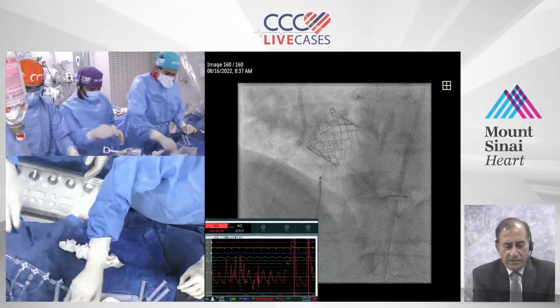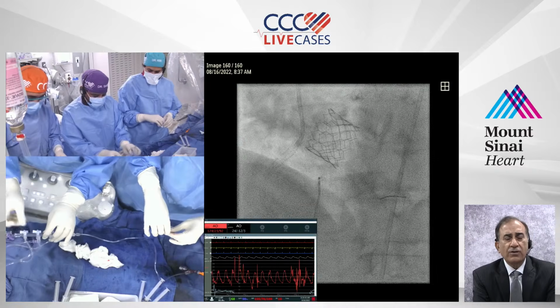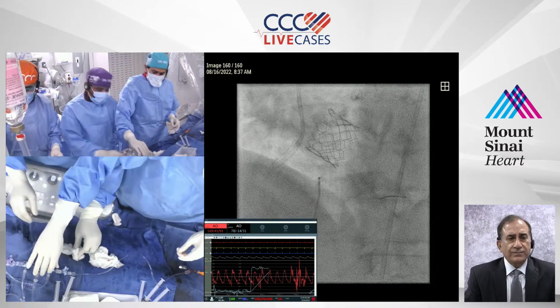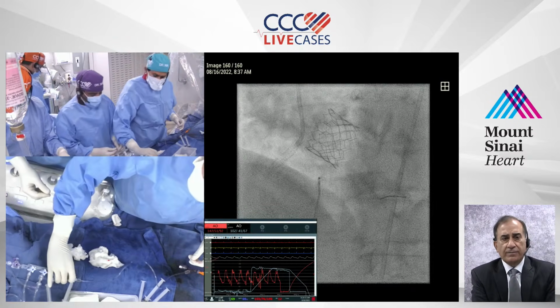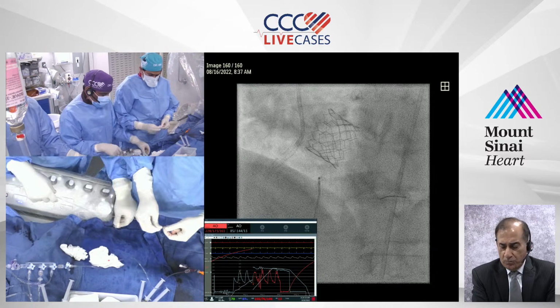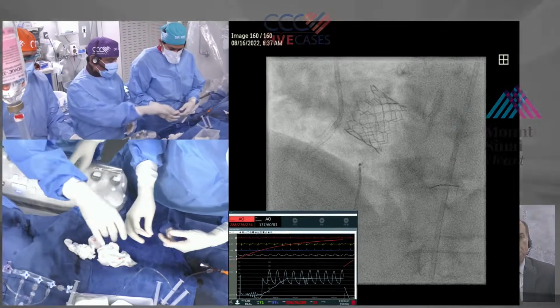Just to extend our academic discussion, would there also be a role of a drug-coated balloon here? Yeah, I would say the drug-coated balloon will be useful here only if you're not putting another stent. But I think we have done a lot of disruption with the laser. In a large vessel, a small vessel is more.